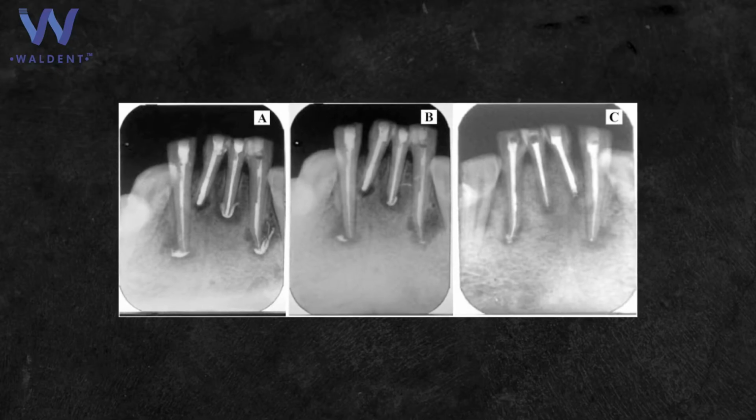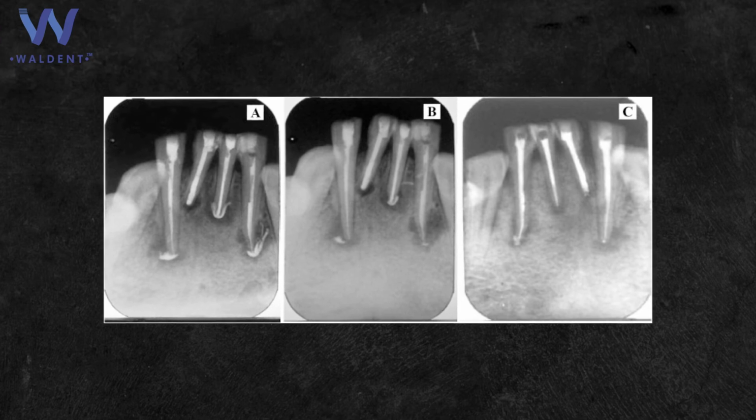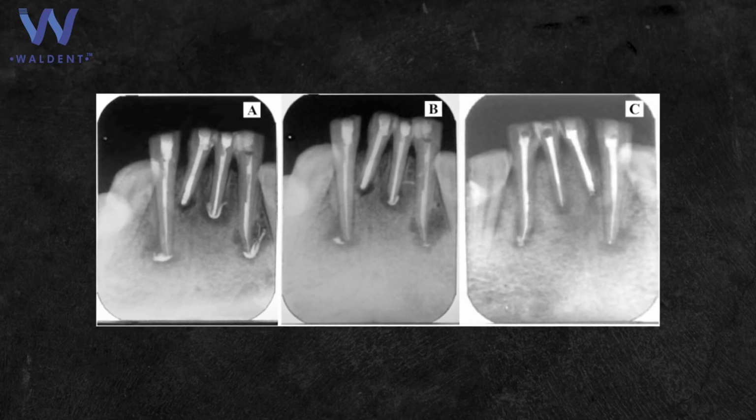Addition of barium sulphate makes the calcium hydroxide radiopaque, which enables the practitioner to observe more readily the healing process on radiograph.